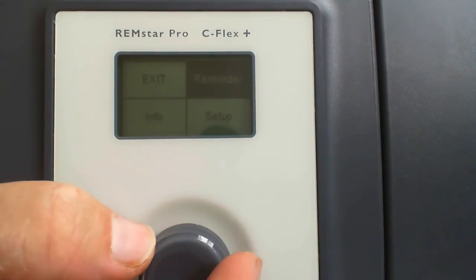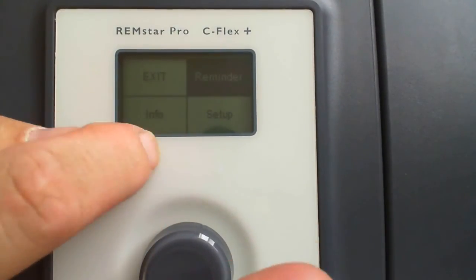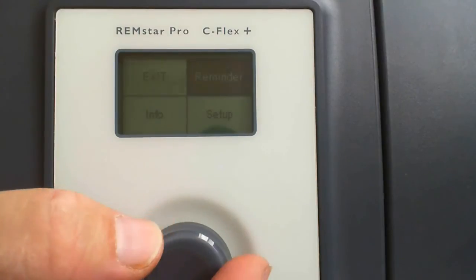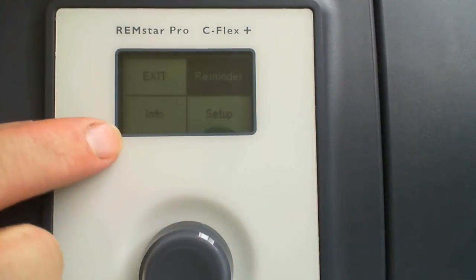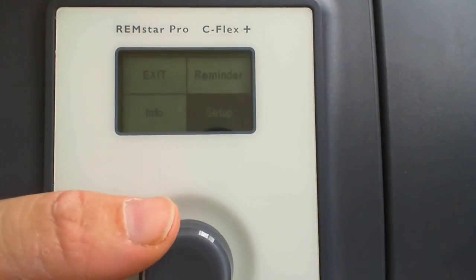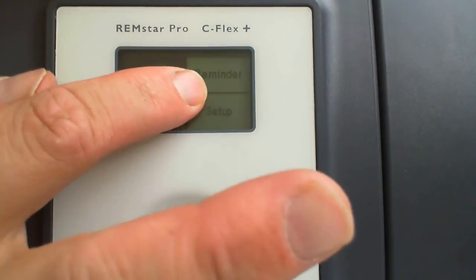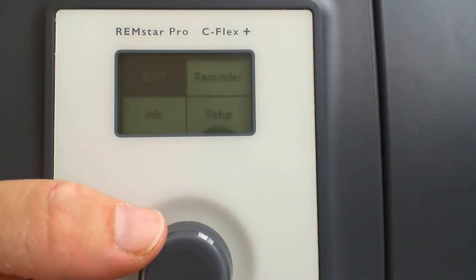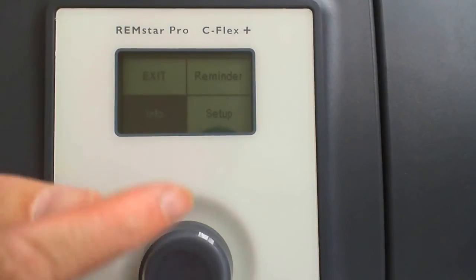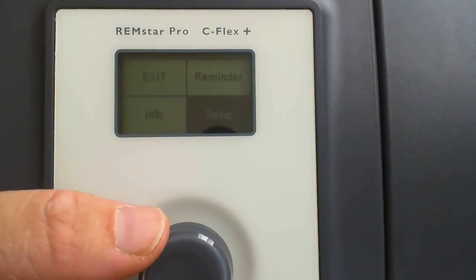Okay, guys, we're back. Now, this is the Clinicians Menu. You're going to notice it has the same 4 squares as the beginning menu on the patient's menu. Notice some differences. Here is exit, so that you can exit out of the Clinicians Menu when you're finished. It's exit instead of therapy. It's reminder instead of your C-Flex setting and C-Flex demo. You still have the info button, lots of duplicate information in here, and then you still have your setup area.